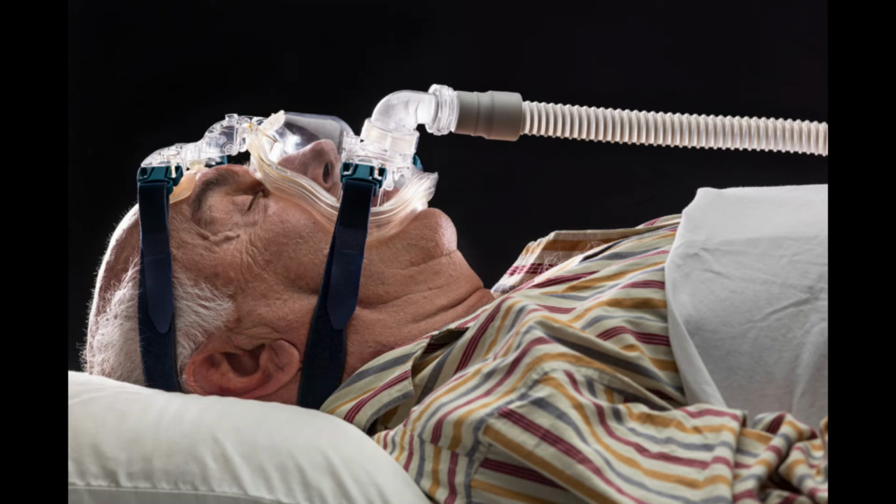For instance, if the patient is calling you on the phone and saying that the mask is leaking and they've tried everything, I would have them put the mask on, turn on the machine, and adjust it so that it feels good and see if it's still leaking during the day as it was during the night. Many times they don't get the leak that they had at night.